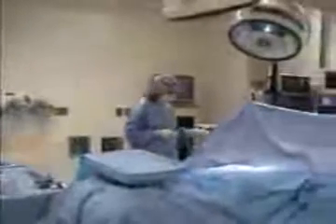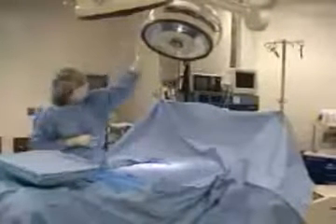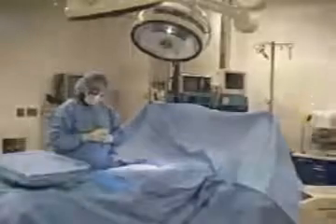Avoid playing with things. You don't know what's laying on these drapes, and as the case begins, there will be many things attached to the drapes. It behooves you to stand back and watch and then step forward as you're invited to do so. Don't touch things like this — I've contaminated my gloves. Normally there are sterile caps up over these white handles. So keep your hands where they need to be, right in front of you.